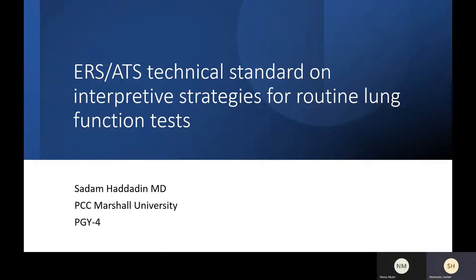So from the time you start until the time you are on the line of takeoff, this volume should not be more than 100 ml or 5% of your FVC. Otherwise the FEV1 will be wrong, and this is why it is not used. It has to be reported by the interpreter, who says they cannot interpret it. My question was, does the system automatically exclude it? No.